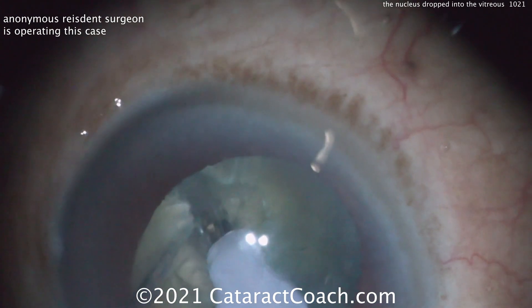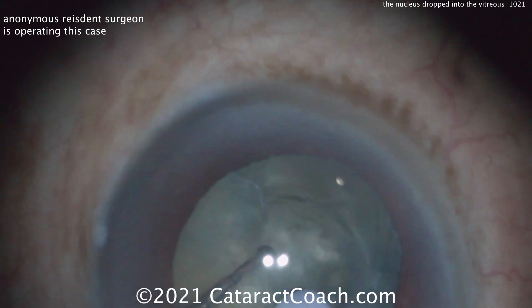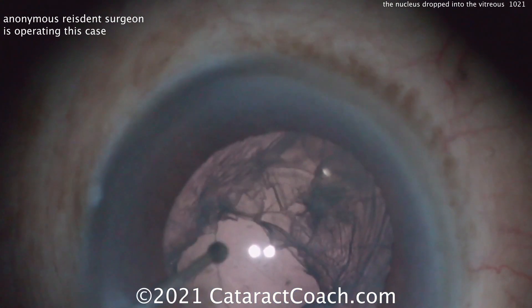And just about now, your posterior capsule is wide open. Look carefully — one, two, three, gone!